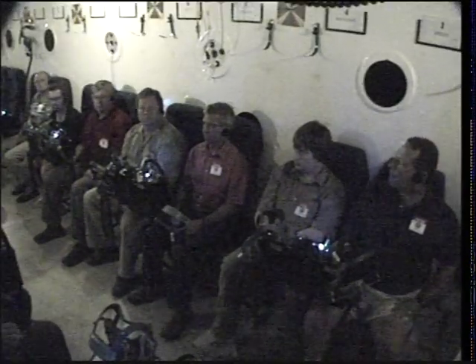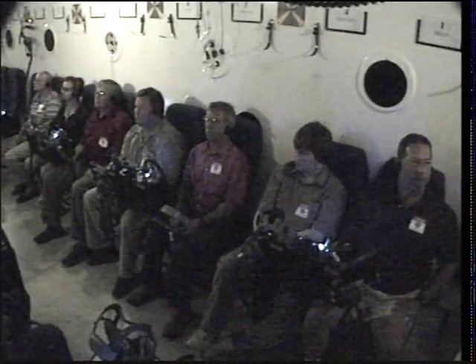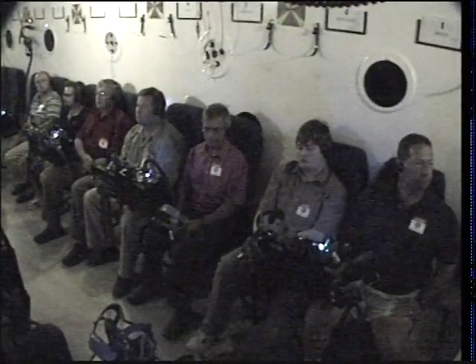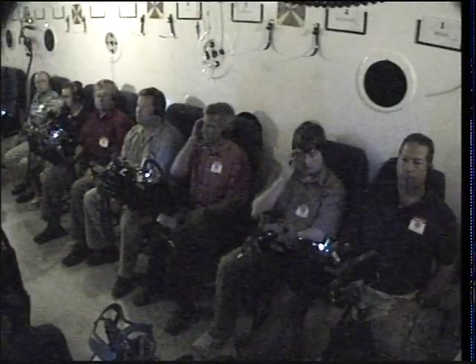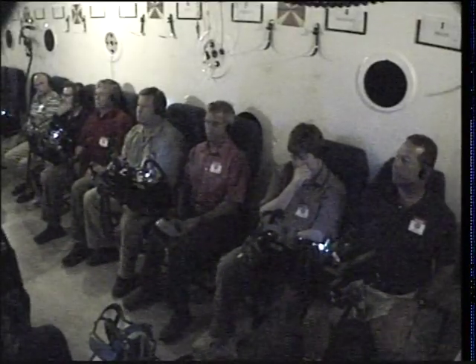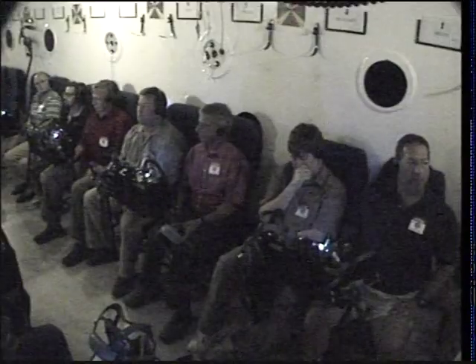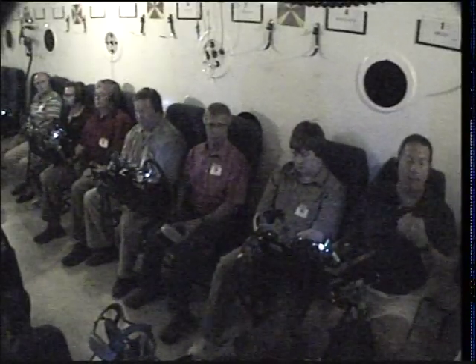And at that time, just go ahead and look at the color chart on the wall to see if you notice any changes. But if we make it to the 2.5 minute mark, you will have a handheld color chart in front of you. Now, what we're trying to show you here is the effects of a low-grade hypoxia on your night vision. Now, you could do the same demo in your aircraft at night as low as 5,000 feet. It would just take a considerably longer amount of time. To speed things up, we're going to do it at 18 to show you the effects of a low-grade hypoxia on your visual acuity.